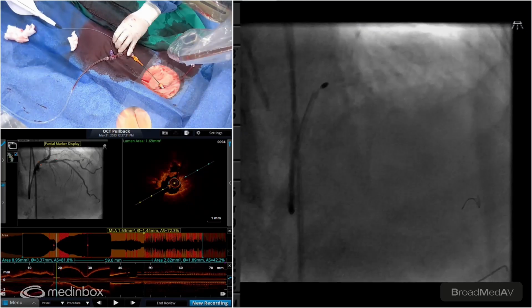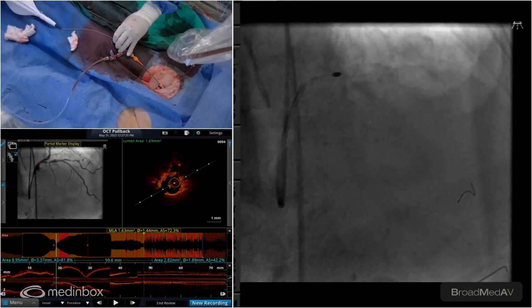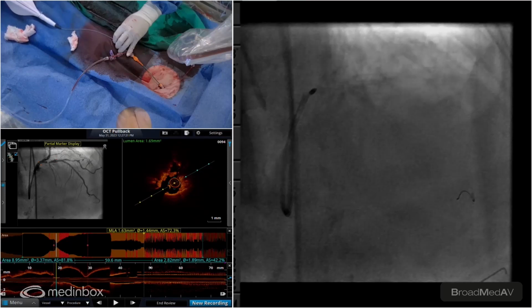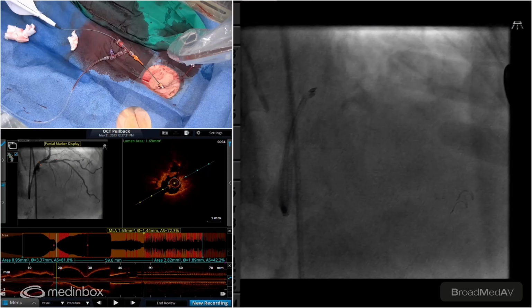It's a large burr. Working well so far. Give it a bit of a rest. Sometimes I start with the biggest burr because that's probably going to be the most amount of particle generation. And as we slowly start shaving, then the particle generation gets less. And then let's try it again.